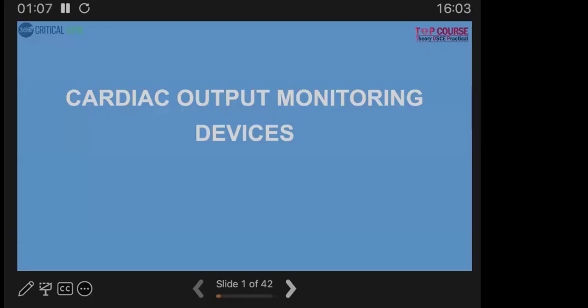Okay, so we'll be discussing a bit of theory, that's true, but I'll be showing you the pictures and possible OSCE pictures where you can interact and answer. Let's see how it goes, okay? So can someone tell me what is the indication for using the cardiac output devices? Why do we use the cardiac output devices? We have arterial line, we have non-invasive monitoring, we have many things. And why do you want to use cardiac output devices? What are the main indications for it?